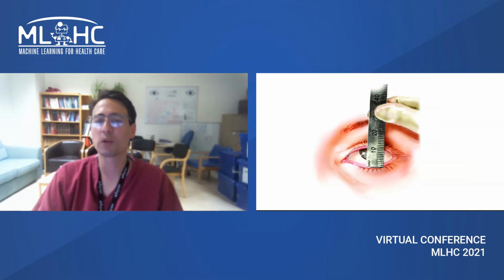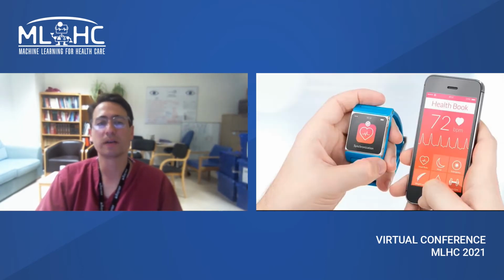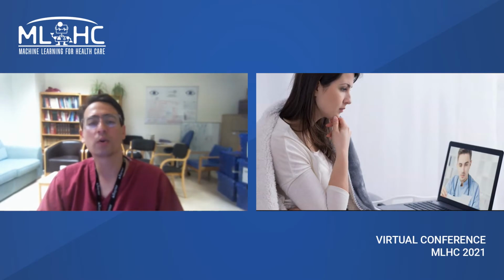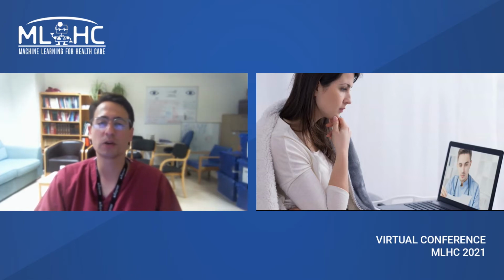Currently, we perform manual measurements to help us quantify eyelid position. That's either to assess disease progression or to measure the success of surgery. But more and more people want to be able to measure their own health status, and more clinical consultations are being performed virtually by video. So my question is, can we get any useful data automatically from those video images?